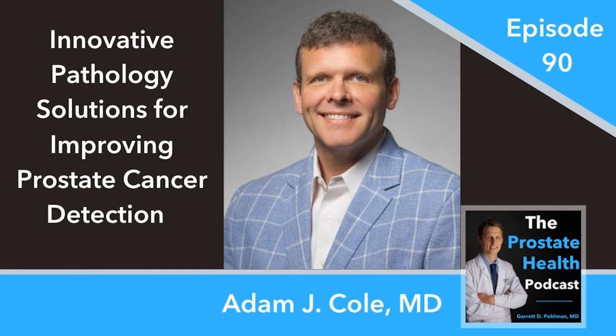We've covered some of these tests on several episodes, including episode 48 with Dr. Crawford, and episode 67 with Dr. Barbieri. I think one point of frustration for both patients and urologists wanting to use this testing to help in decision-making is that we don't always get a definitive result back. Definitely more often than we like, we get a result back that says, quantity not sufficient to test the panel ordered, or QNS. Could you explain what it means to have a quantity not sufficient result and how TruCore is helping in decreasing the QNS rates?